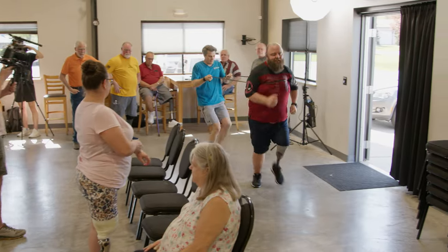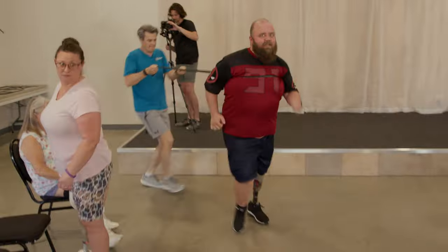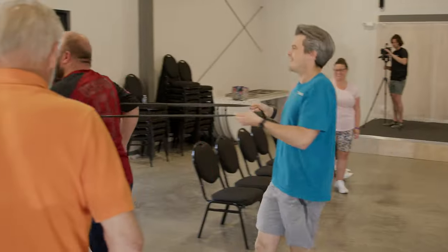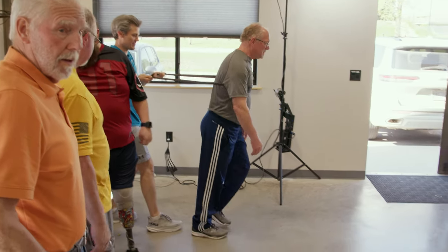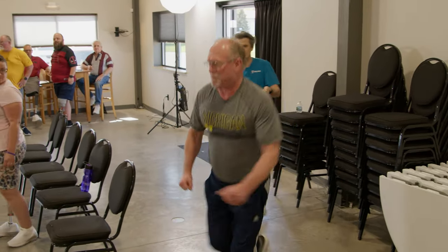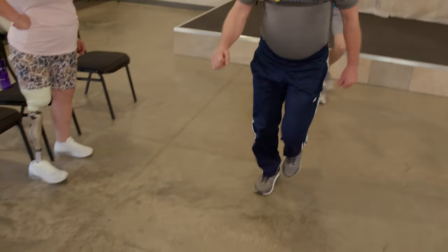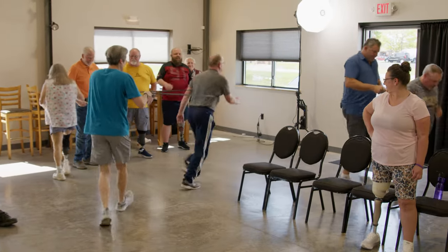You're looking good, do another one. Nice, good job. Whenever you're ready, Dale — let those arms go like you're running. Swing your arms, bend your elbows. There you go — lean far, lean a little bit more, push with those legs, push!